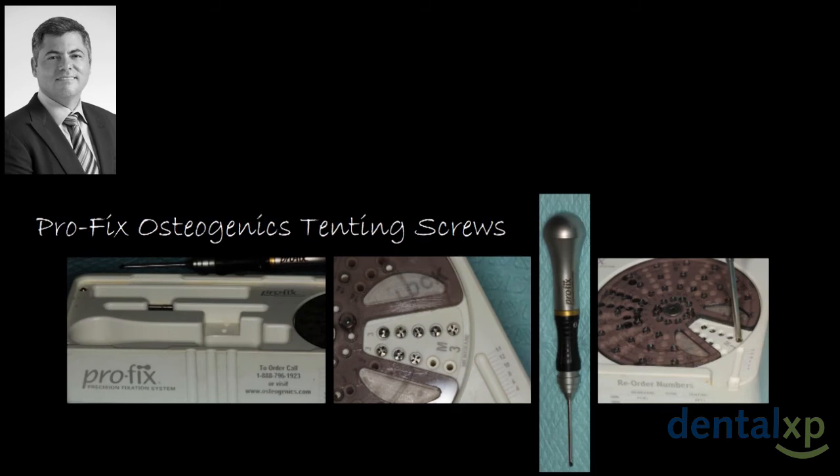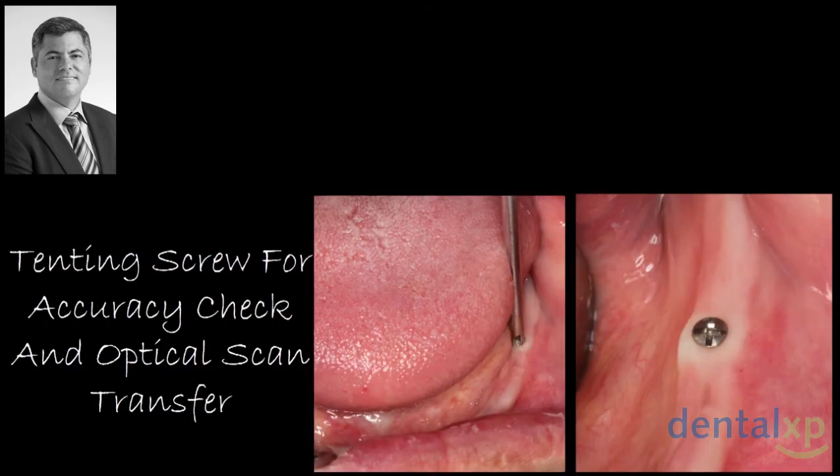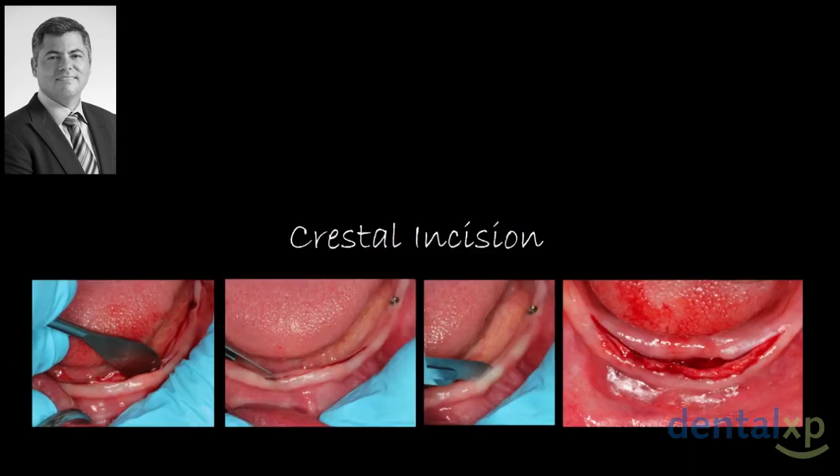One of the important things, and I want you to follow this carefully, is that, remember I told you that every time you calibrate the burrs, you have to make sure that the calibration is precise. In an edentulous patient, you don't have anything to check and test the calibration. So one of the procedures that we're doing to check and test the calibration is utilizing tenting screws that we're placing in the posterior area. Now this device is going to be the testing device, because you're going to scan the patient with this device in place. So basically, now you have a device that you can utilize to test your calibration. Number one improvement in the protocol that we did.